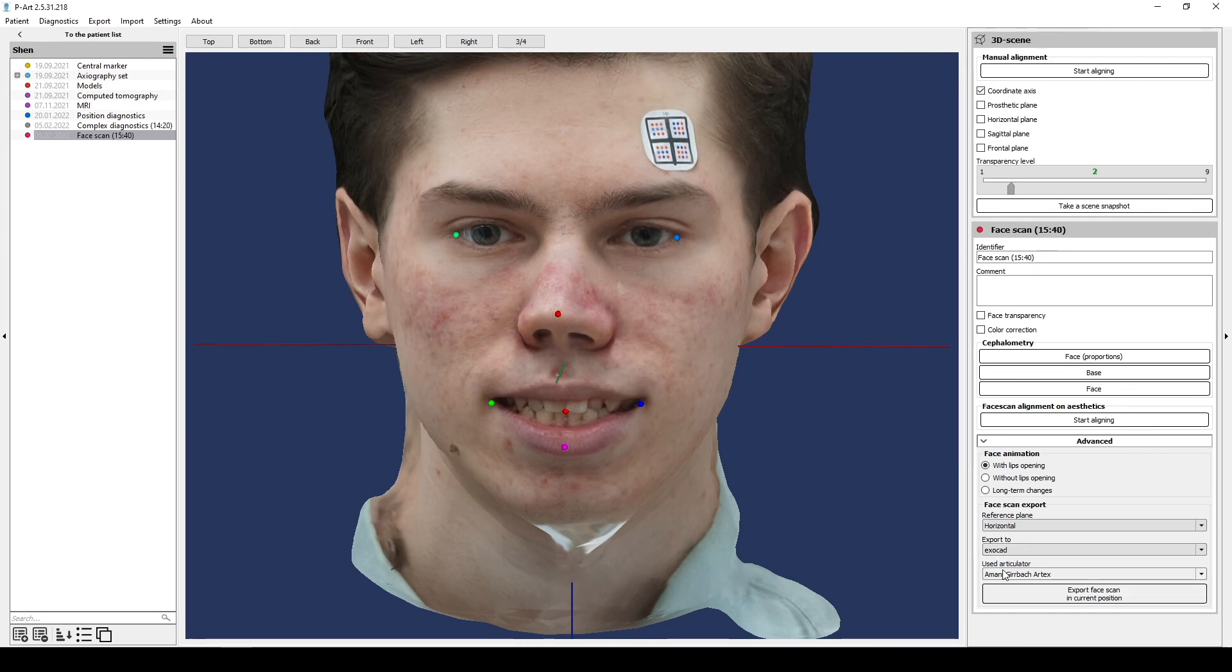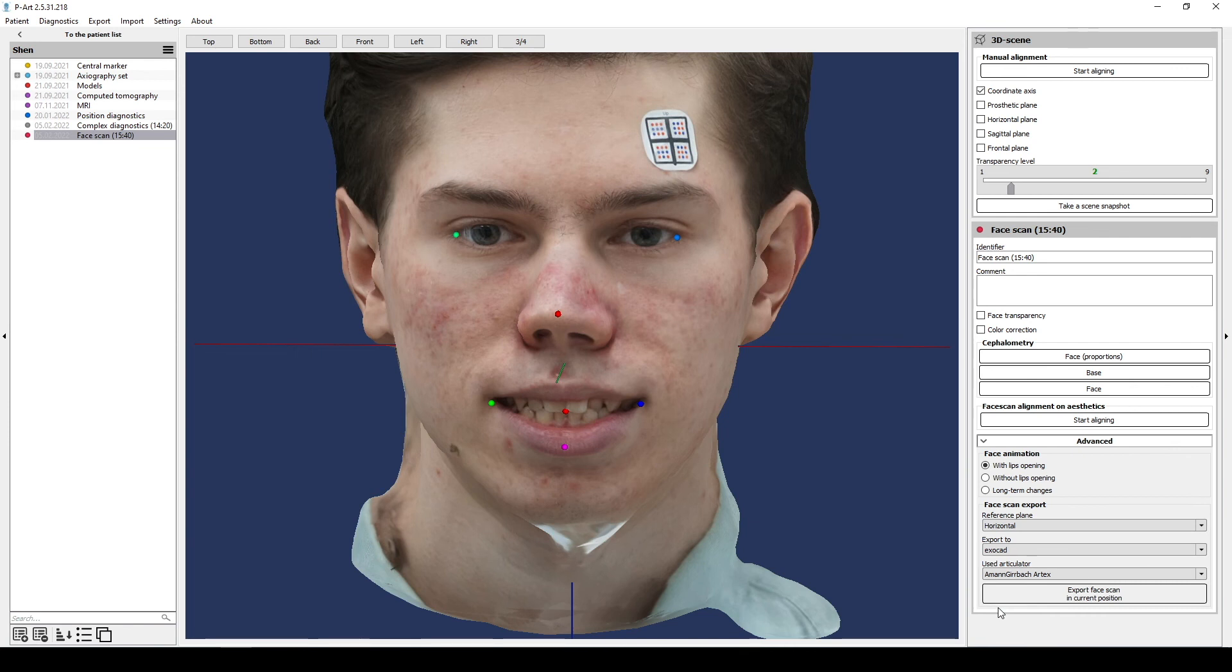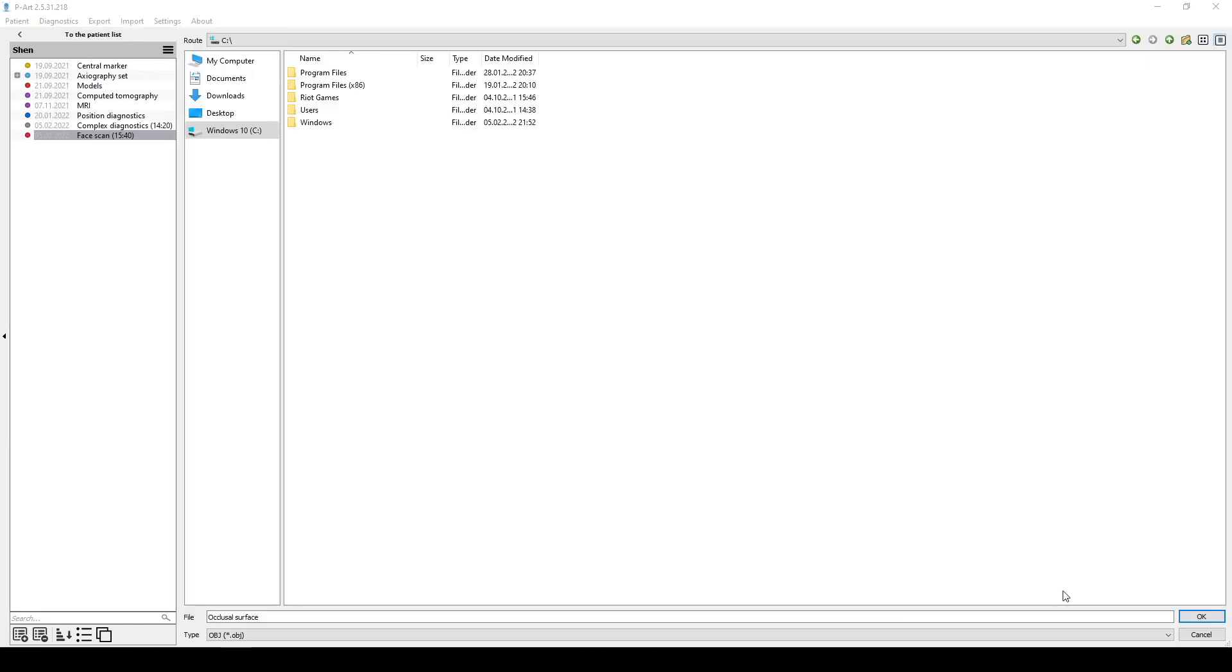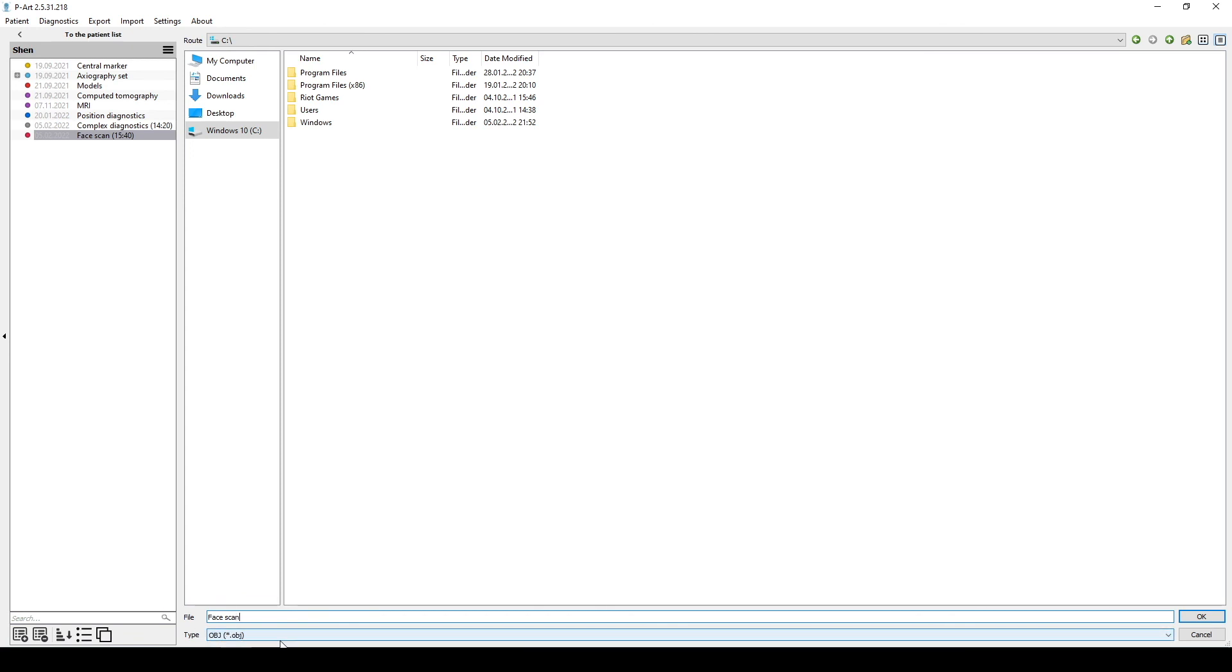Then click Export face scan. Select the location to save face scan files. It's saved in OBJ format. The program creates a folder with three files. When you will upload the face scan in ExoCAD you need to select OBJ file inside the folder.